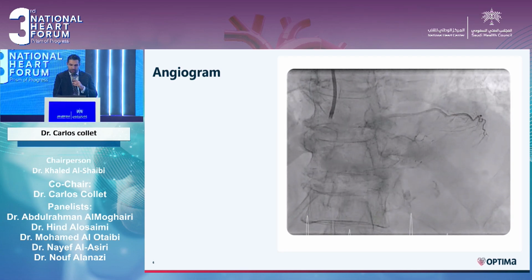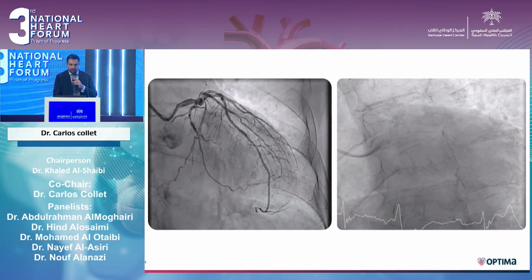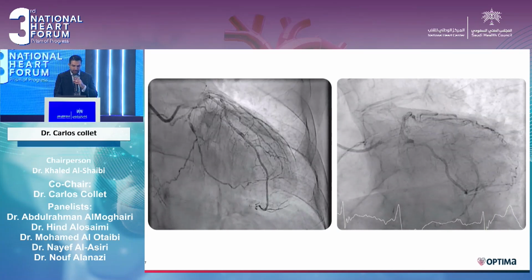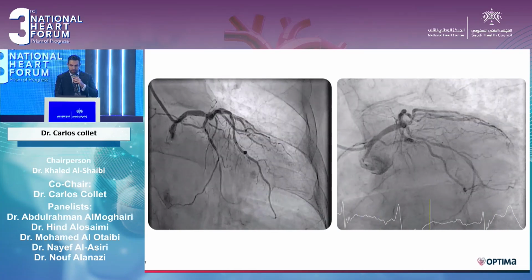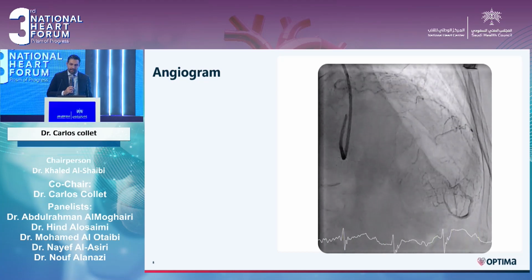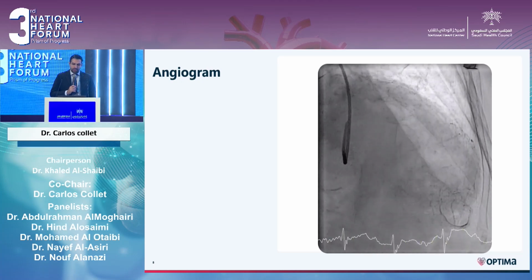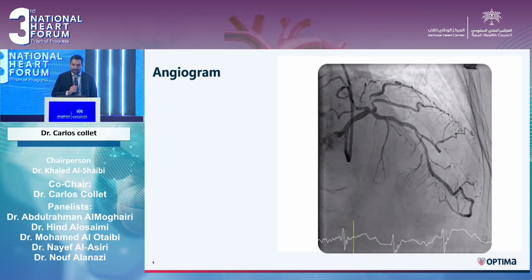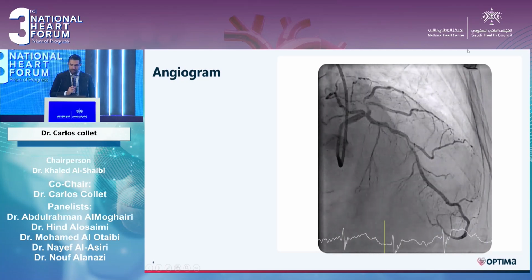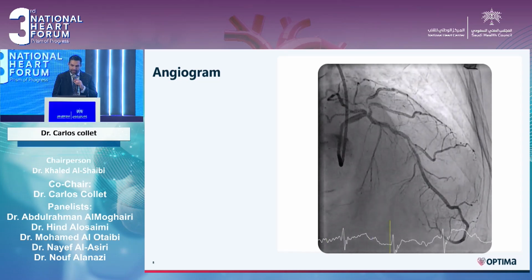You see here a tight lesion in the distal right coronary artery, a very severely calcified vessel, and these are the shots of the left system. You see there is mild disease in the distal left main, and again, it is difficult to interpret the angiogram. There are many branches here, but I think we have a nice cranial shot showing basically distal left main stenosis at the level of the bifurcation of the left main, but a very close diagonal branch which bifurcates, so a very large myocardial territory subtended by that, and again, a second lesion in the mid segment of the LAD.